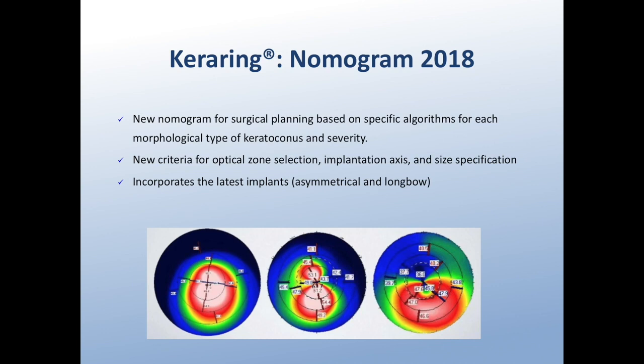It goes to fill the gap that was left by the old nomogram in 2009, so in 9 years we did not have a nomogram upgrade and only allowed us to use the 2009 version. Thanks to our Spanish colleagues, the new nomogram is finally made available to everyone.